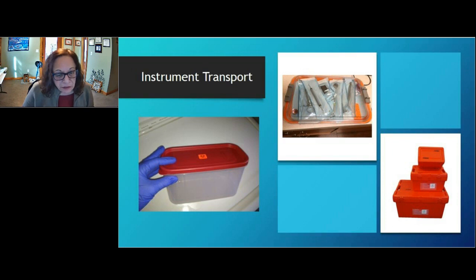Great. The only problem I have with that would be, how do you clean it? How do you know how to clean that properly? Again, this was purchased at a grocery store or a retail store somewhere, not intended for medical use. Therefore, there's not going to be healthcare oriented instructions for cleaning and disinfection. It's going to tell you, just wash it in warm soapy water. That's what you would do at home. And these are basically residential use containers.